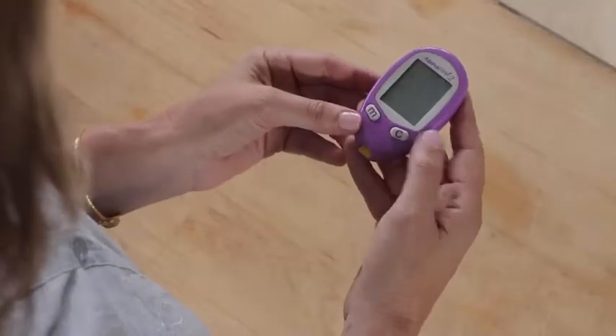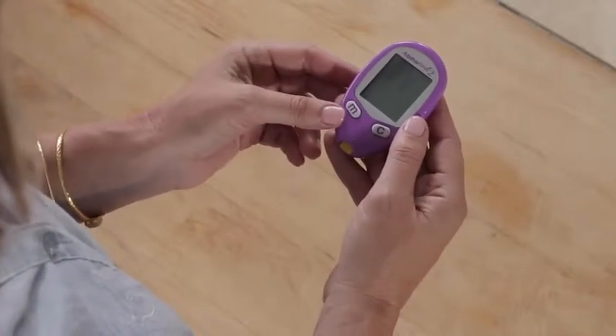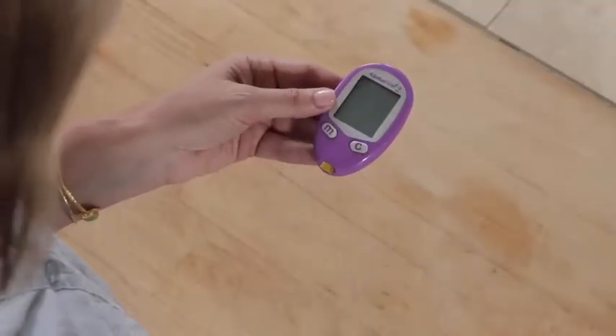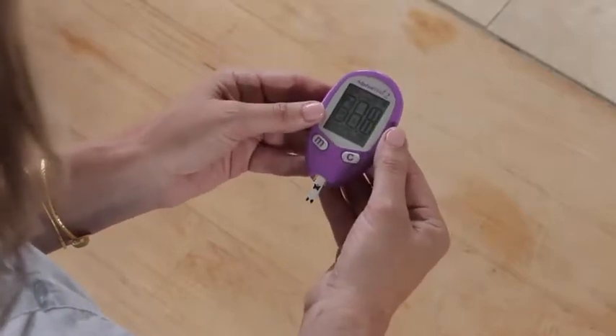Your starter kit comes with everything you need to get going. On the AlphaTrap2 meter, the M button helps you move through different settings and scrolls backwards. The C button marks a control solution test, scrolls forward, and helps change other settings. The test strip port is where you insert the AlphaTrap2 test strip to turn the meter on during the test. Remember, you can only use AlphaTrap2 test strips with the AlphaTrap2 meter.